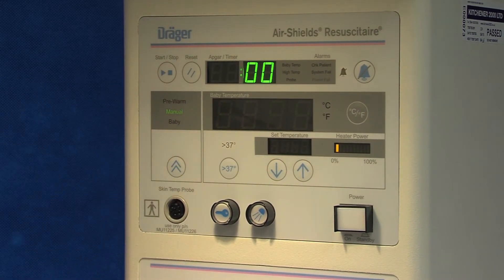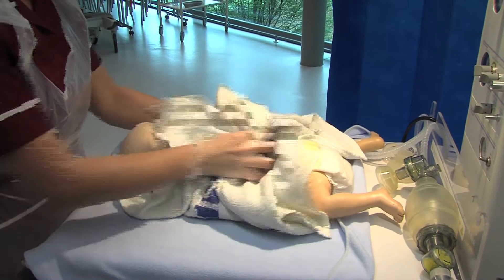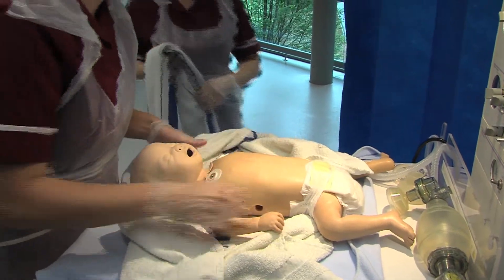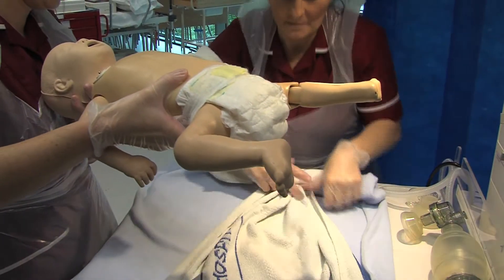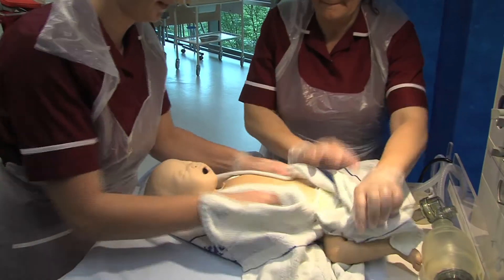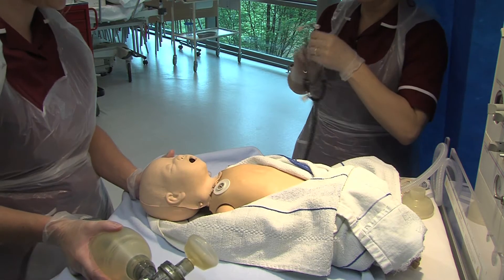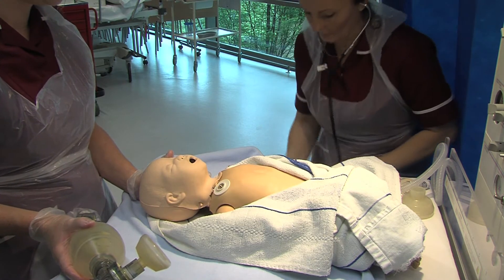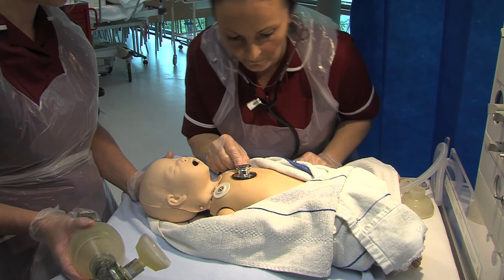Start the clock immediately and note the time of events. When you receive the baby, it is important to dry the baby and then wrap the baby in a clean warm towel. Once the baby is in a nice clean warm towel, you need to expose sufficient amount of the baby in order to visualise the infant's chest. Assess colour, tone, breathing and heart rate. It is important to use the stethoscope as gold standard when auscultating the infant's heart rate.